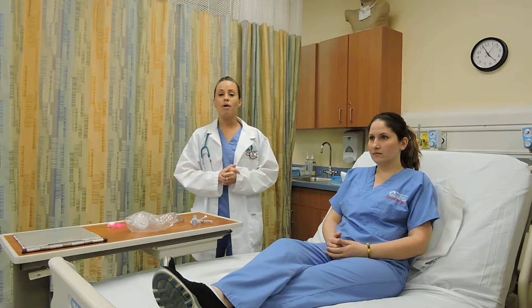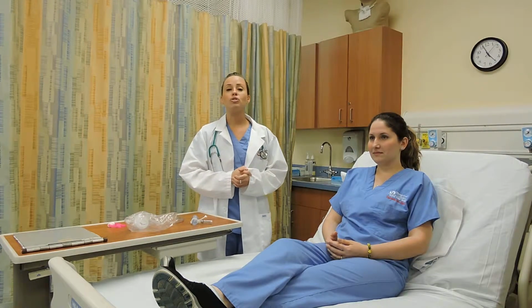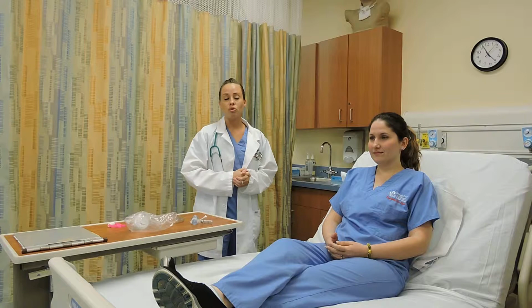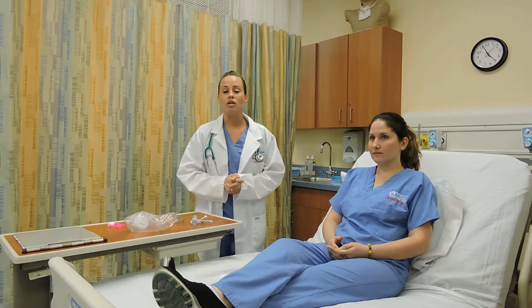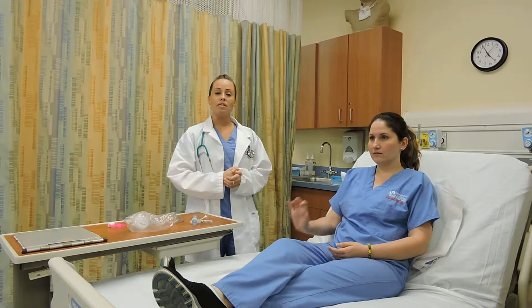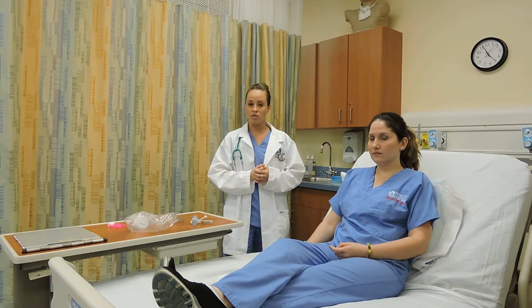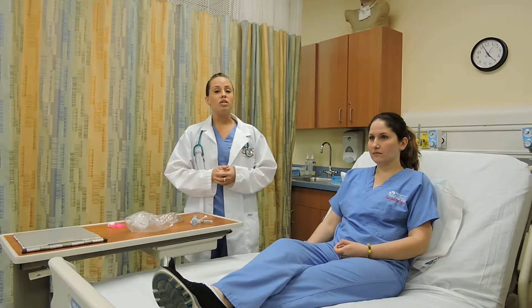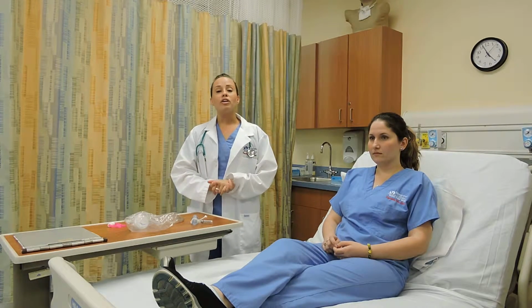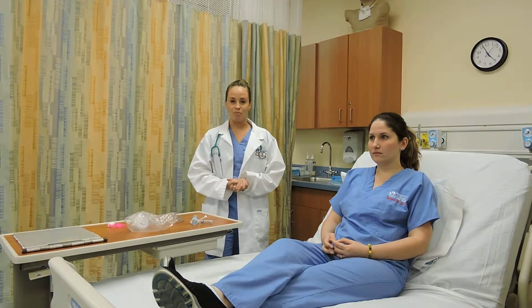On the other hand, EzPap is contraindicated in patients unable to tolerate the increased work of breathing, intracranial pressure greater than 20 millimeters of mercury, hemodynamic instability, recent facial, oral, or skull surgery, esophageal surgery, untreated pneumothorax, acute sinusitis, and epistaxis. As any other medical procedure, EzPap has its possible complications and hazards. These can be the increased work of breathing leading to hypoventilation and hypercarbia, cardiovascular compromise, and air swallowing, increasing the likelihood of vomiting and aspiration.